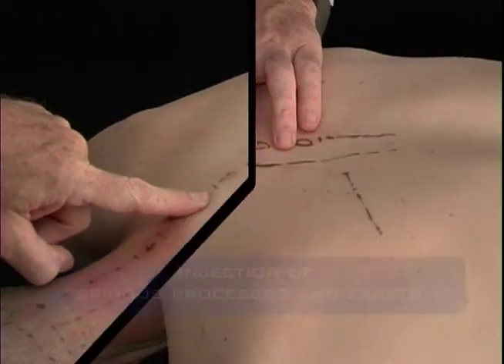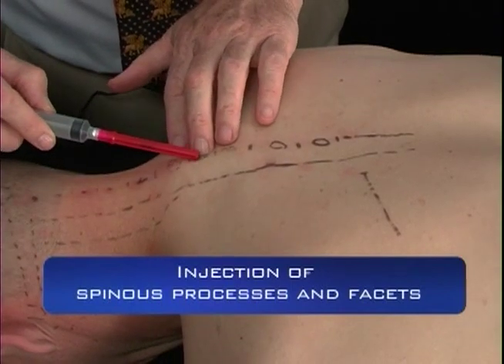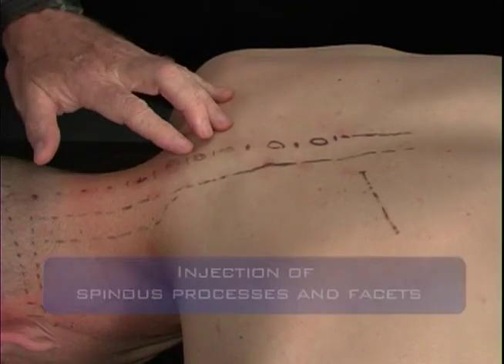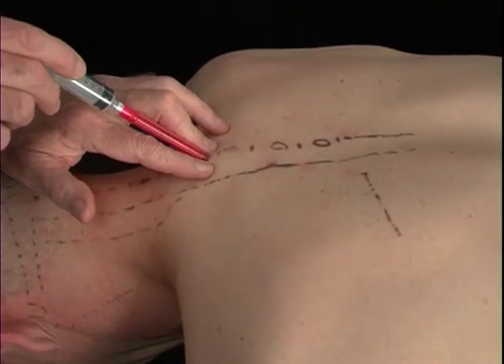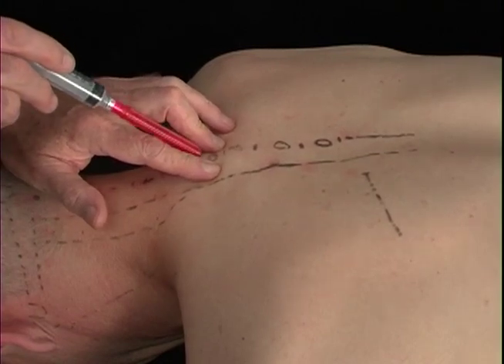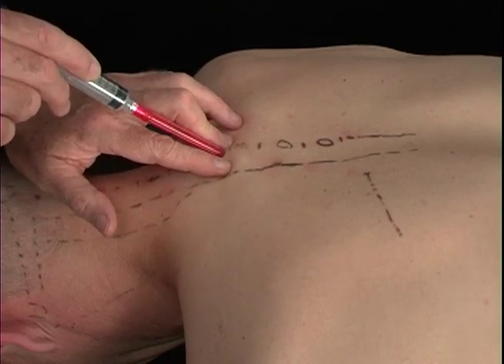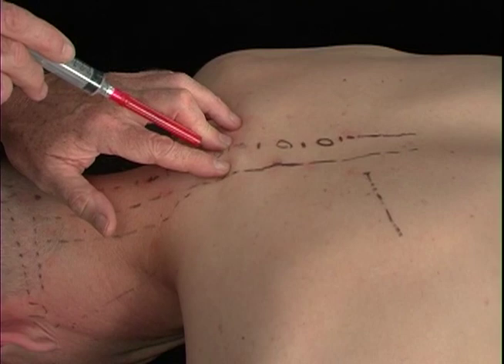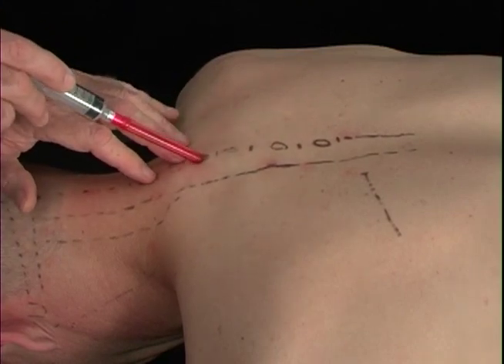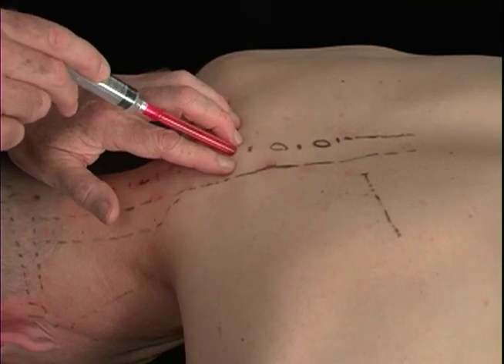Our next injections are carried out on the facets, which, as we said, are 1 finger breadth off of the spinous processes. Our next important injection site, we've done the spinous processes and the interspinous areas. And again, to reiterate, we come into the spinous process, and then we can come back out with a needle, and without pulling the needle out of the skin, slide down and go into the interspinous area in between the two. When we bring the needle out and let our skin go, we need to remember that that's where our injection was, even though the needle stick is up this high. So our next needle stick is going to be down a bit lower.